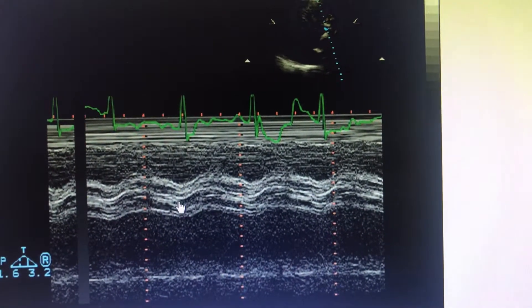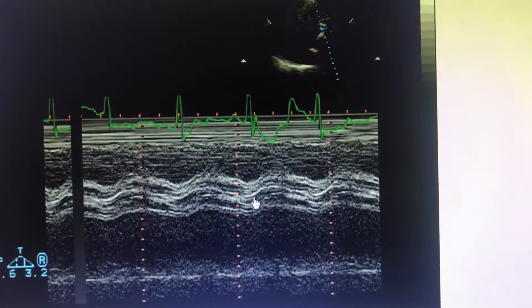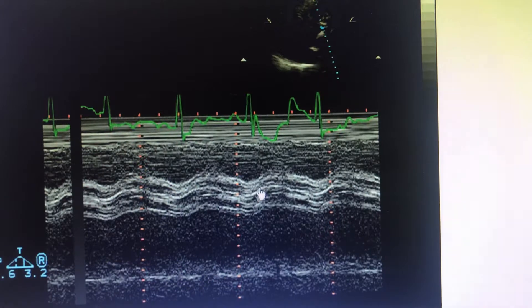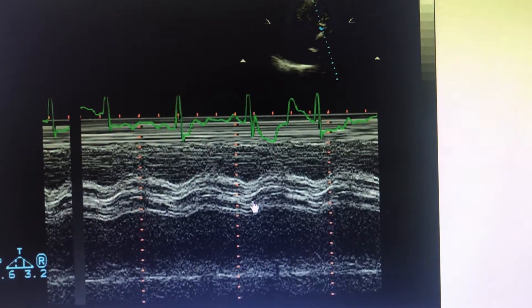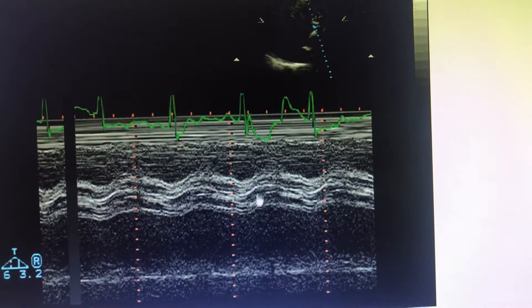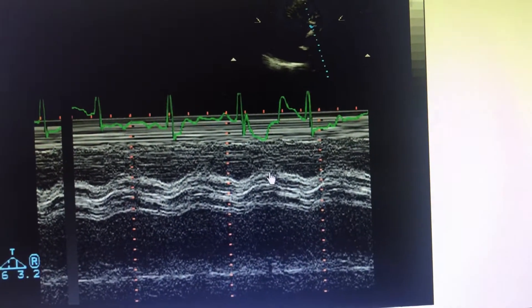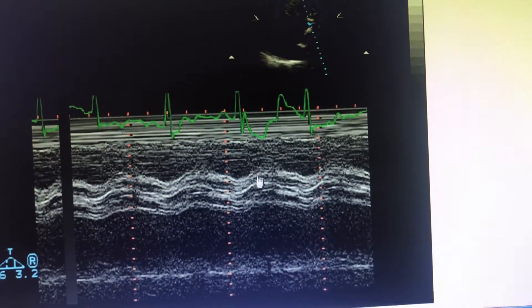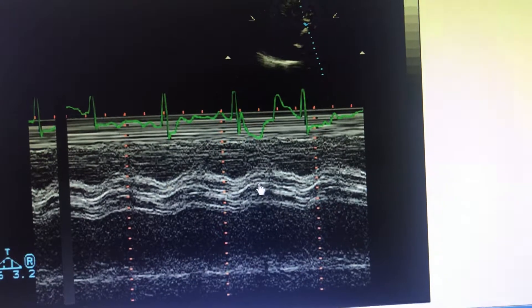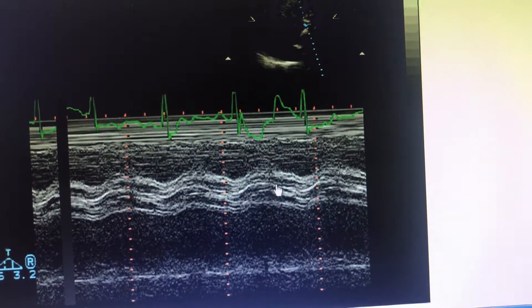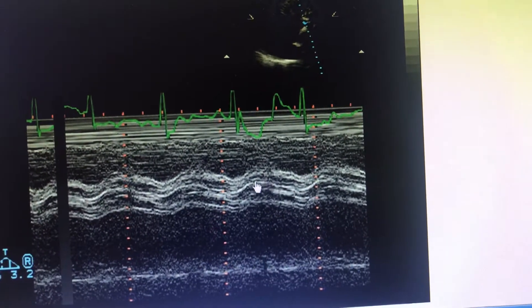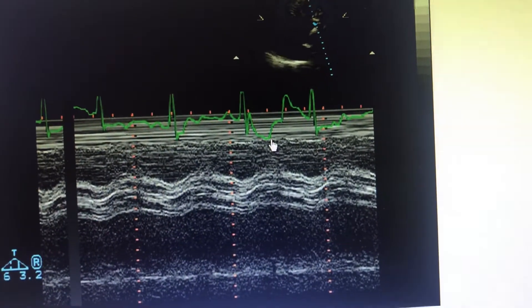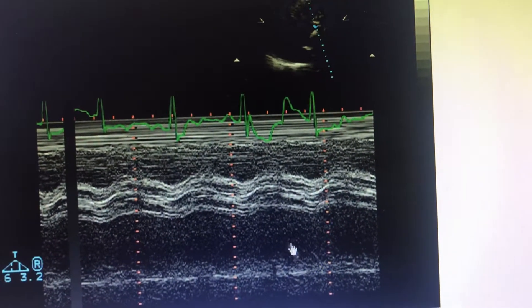The reason is that this is the aortic root, and the aortic root is most probably calcified. This is the aortic valve. Usually what happens is that in diastole, in the early systole, the aortic valve will be seen slightly opening, and then as it opens fully, it will not be seen through the aorta because the aortic valve is perpendicular to the M-Mode cursor. So there will be a clear black area in a usual M-Mode where the cursor passes through the aorta.